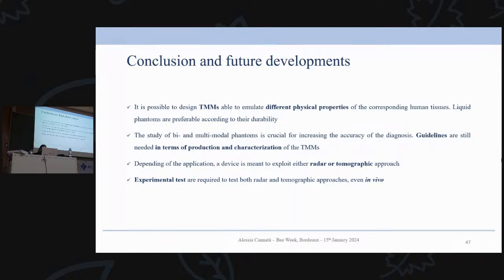And we have seen that there are two methods to reconstruct the signals collected by antennas, radar or tomographic approach, based on the kind of application, based on the medical question.